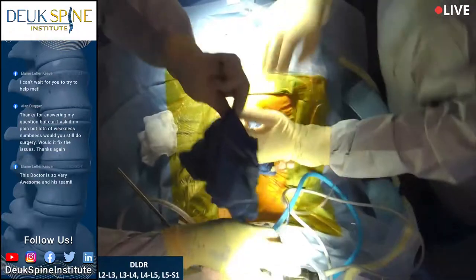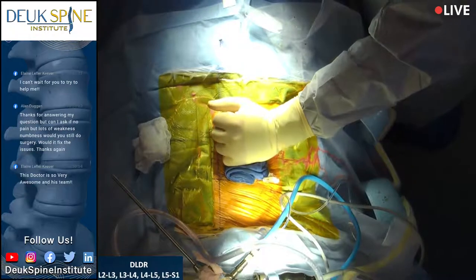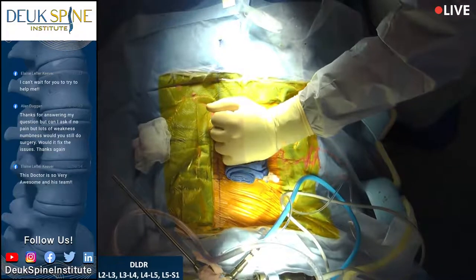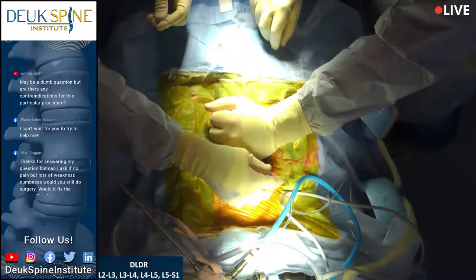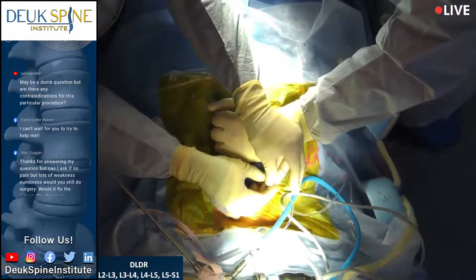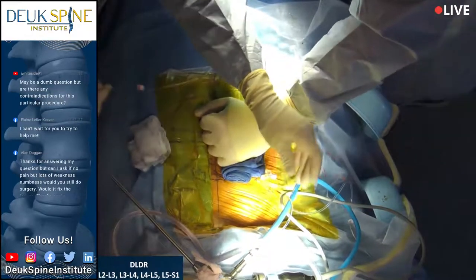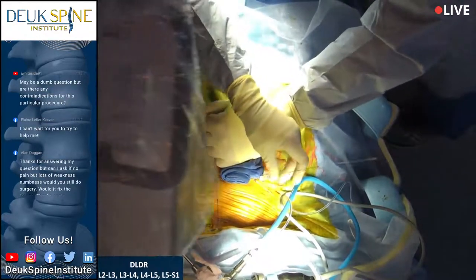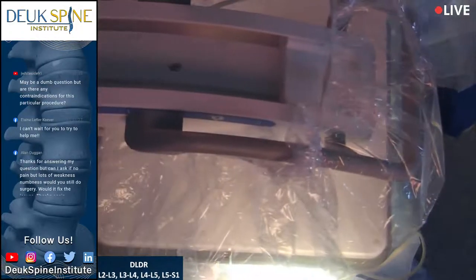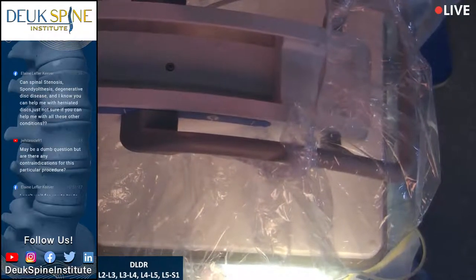Can we do, you don't mind? Skin is not where the pain is. But yes, I will. I'll be happy to do that for you. Do you mind if we do the other one? No? Please. Yeah, we're not going to crush the tube. I can tell you that right now. Luis is worried we're going to crush our tube, and he wants to get through, because some discs are so collapsed that you can actually get a crushed tube. And I don't feel like this guy is going to give us a crush tube. Exactly.